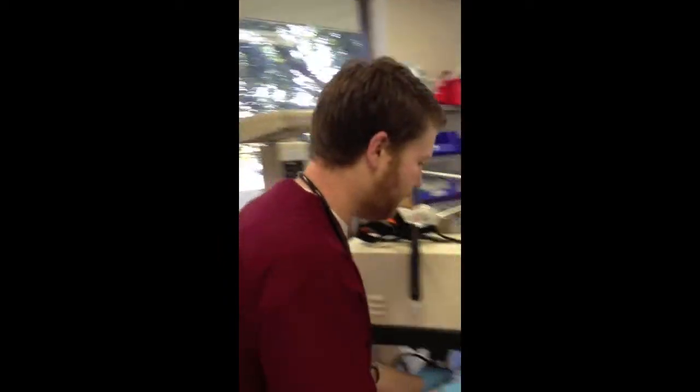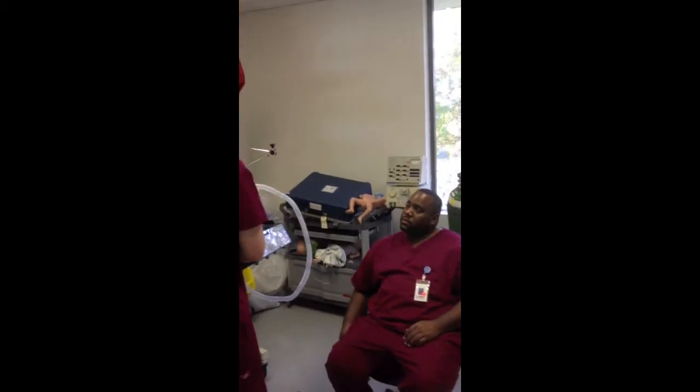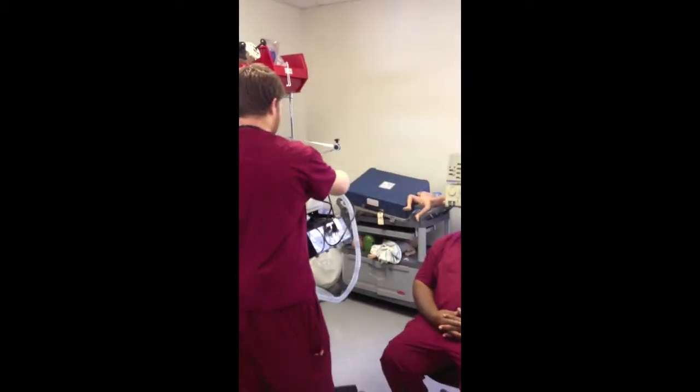Hello there, sir. Hello. I'm with respiratory. My name's Blaine. How you doing, Blaine? Doing okay, thank you. I'm going to be hooking you up to this machine here, okay? Can I go and check your wristband there?